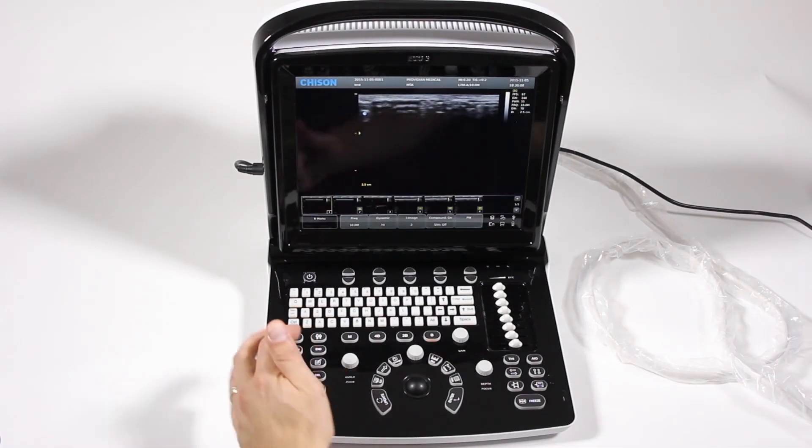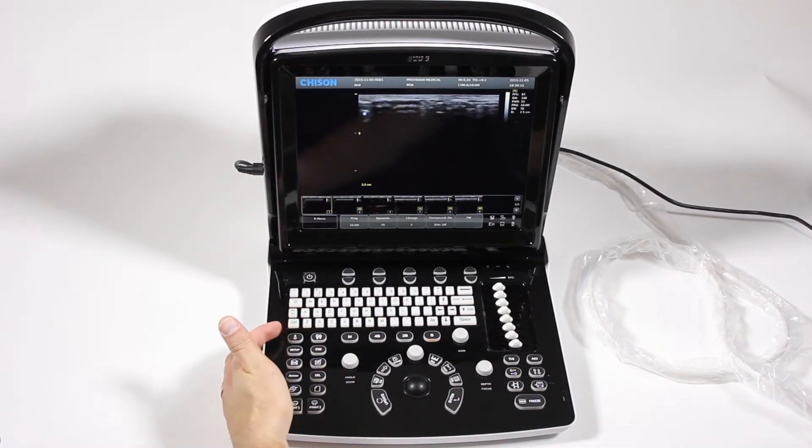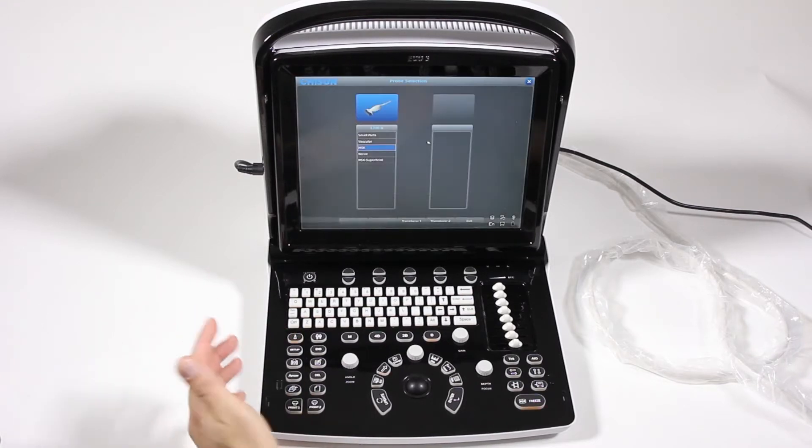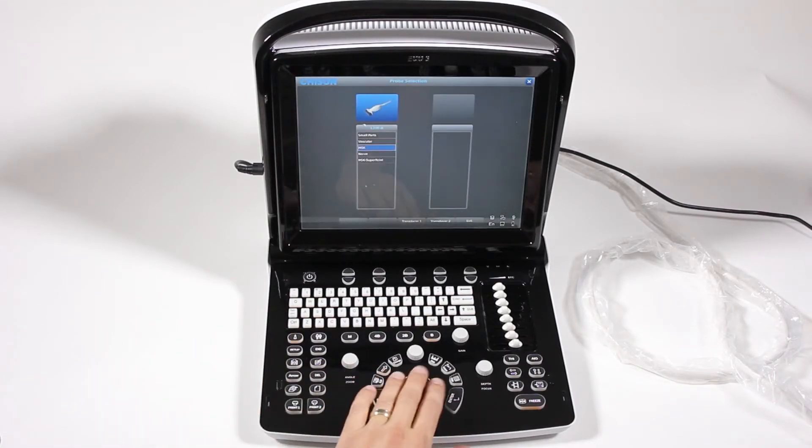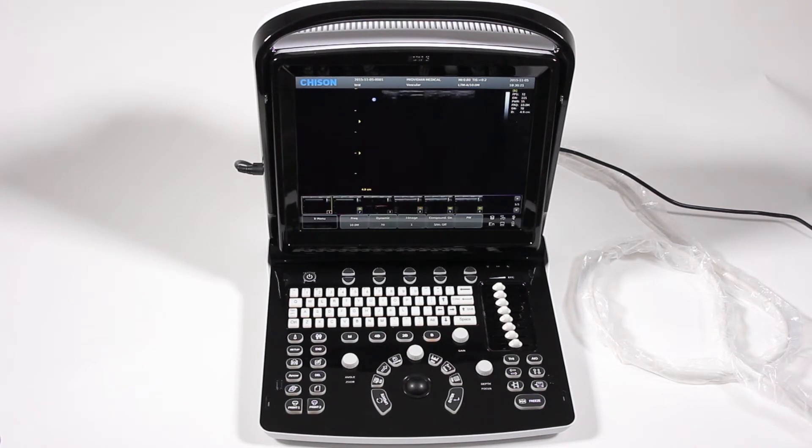For Doppler and M mode, let me first change my preset, which you can do during a regular exam. If you want to change your imaging mode, just hit the probe button and you can choose a new preset. So I'll go ahead and choose vascular, and it's ready to go.